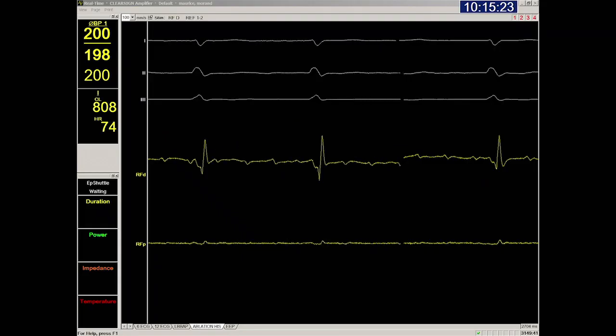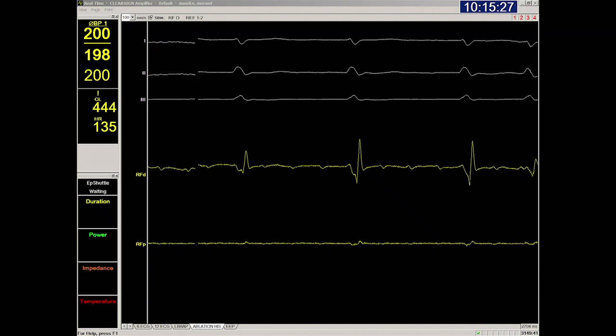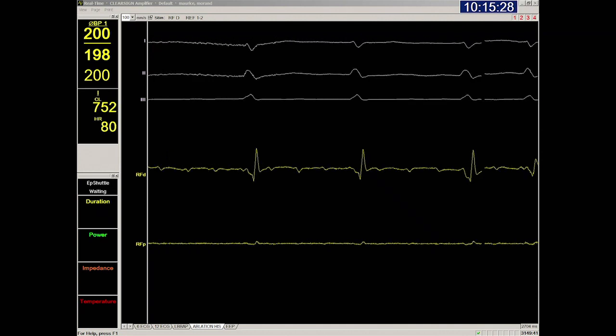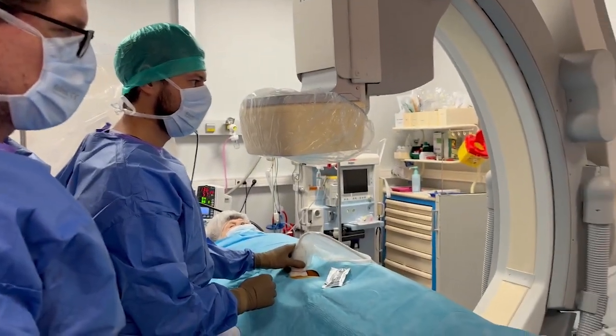In this video we will show you how to perform AV nodal ablation. The patient was implanted with a left bundle branch area pacing lead and an RV backup pacing lead three weeks prior.